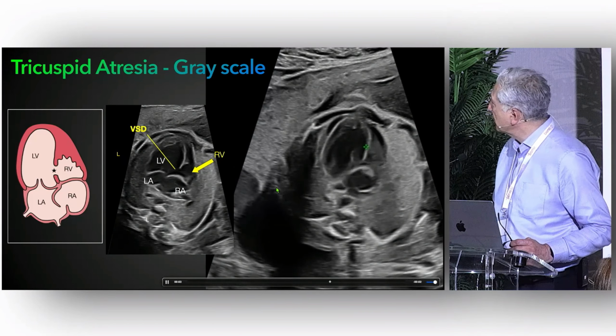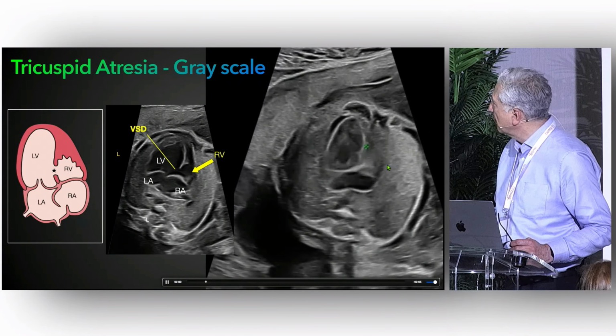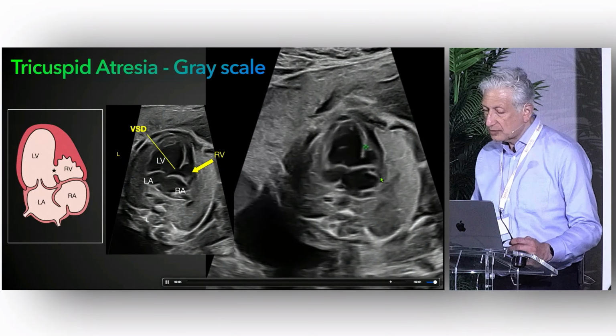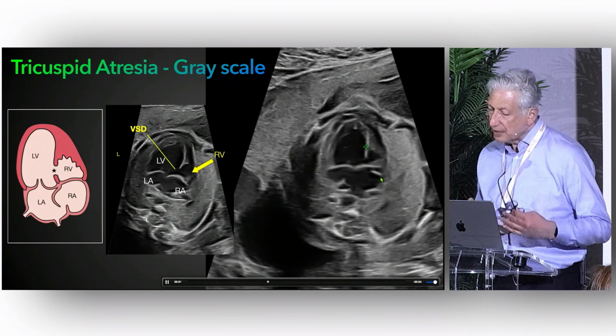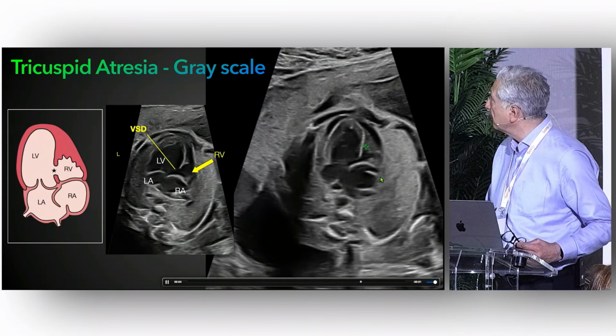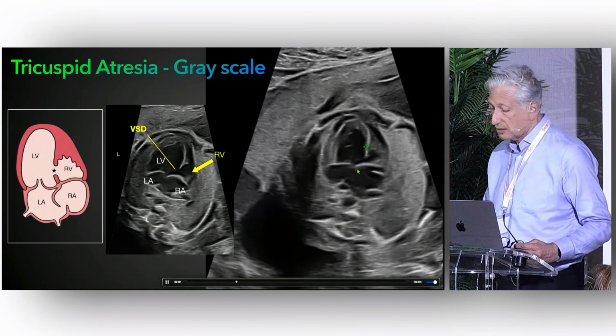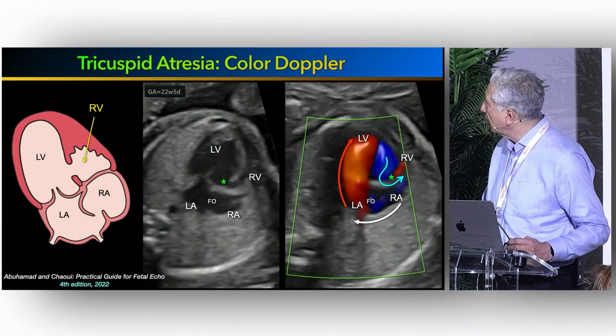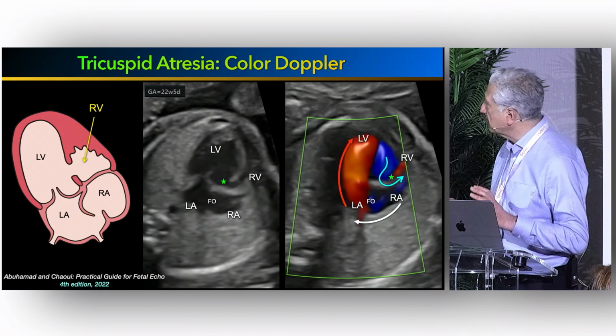You have the impression that something is moving here, but this is an echogenic thickened apparatus, a kind of remnant of what would have been a developing tricuspid valve, but always closed. With color Doppler, it's quite interesting because it has a typical pattern.